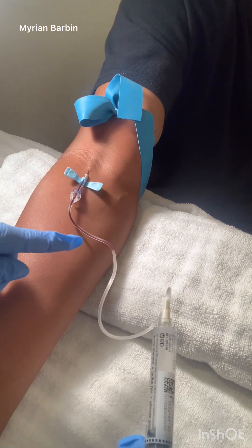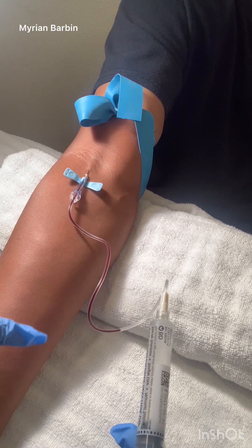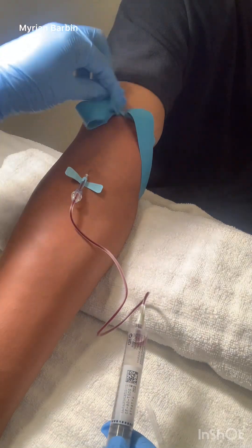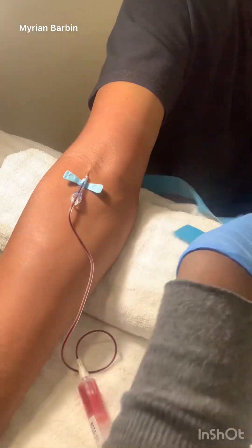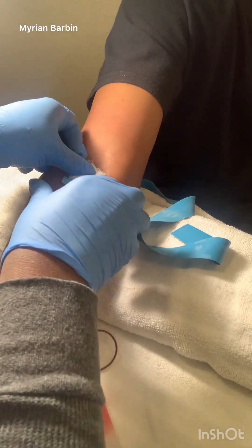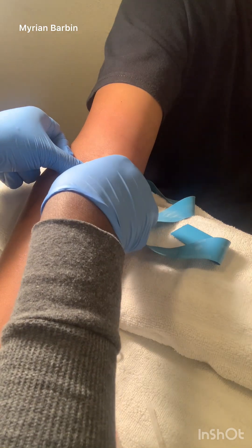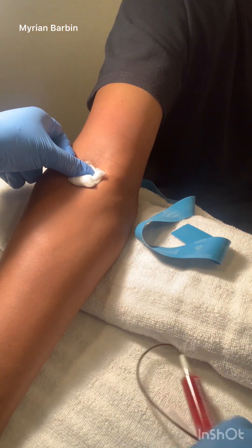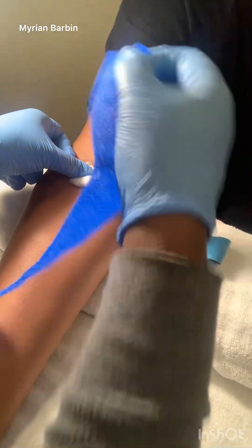If you are drawing blood, just pull back on the syringe and attach it to the end of the tubing. Undo the tourniquet. Now to remove the needle, apply gauze. Make sure you dispose of your needle in a sharps container.